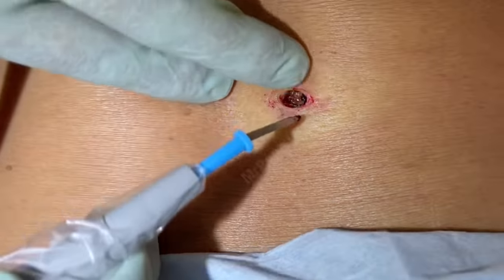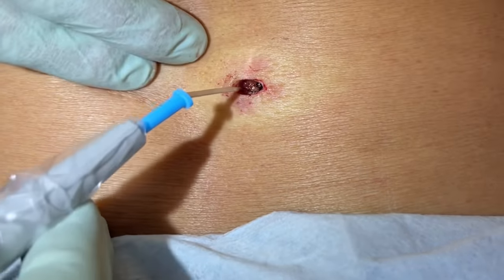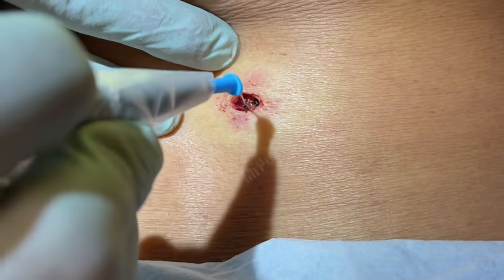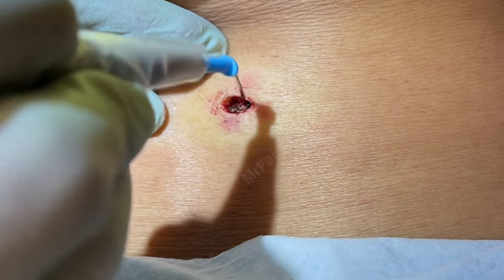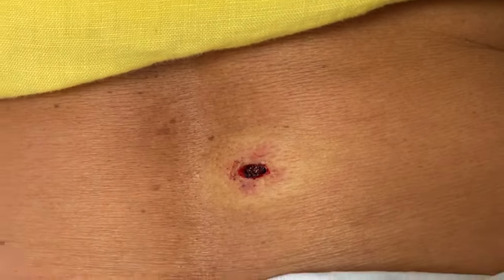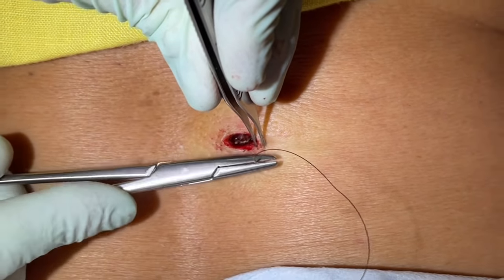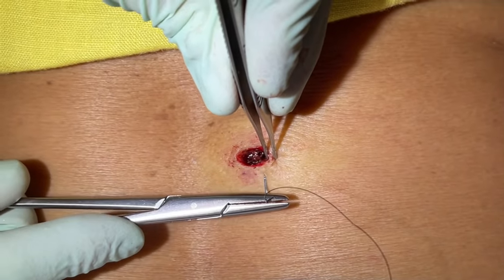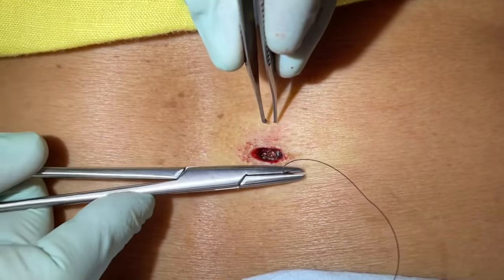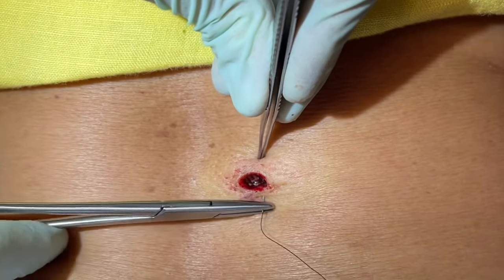Just a couple of simple interrupteds, and we have about a one centimeter closure there. That is good, and that will never come back now. Skin's pretty thick there.